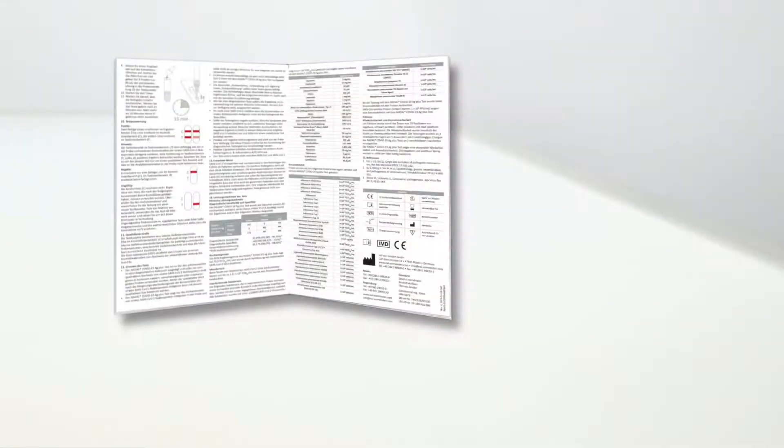In this video, the instructions for obtaining swab samples from the nose are based on those provided by the Robert Koch Institute. Please also read the instructions in the package insert of your COVID-19 antigen rapid test kit.